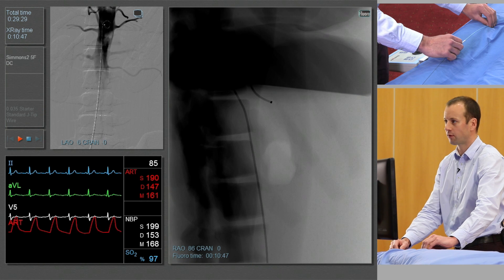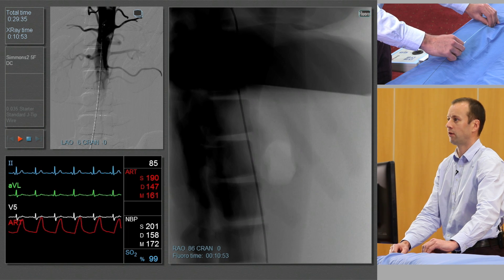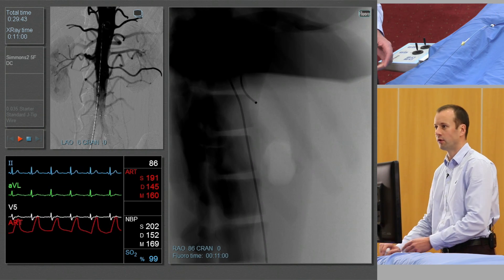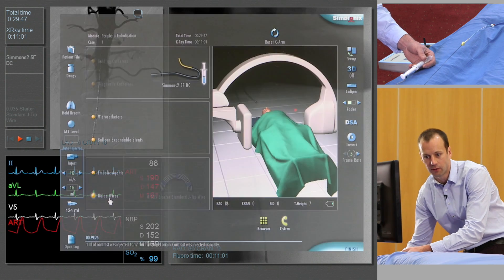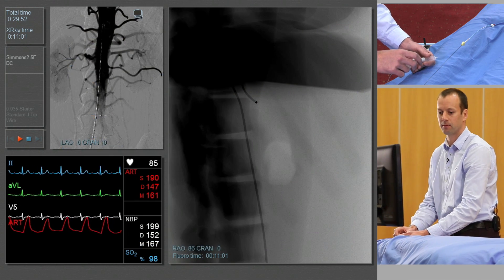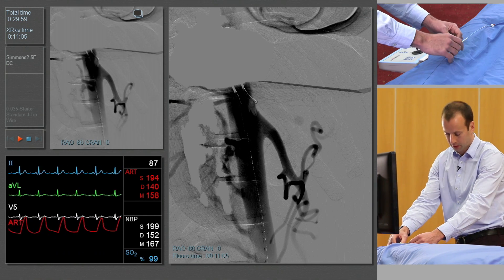To disengage from the celiac artery, we push the catheter back up into the aorta. We can see a poor view of the catheter because of the diaphragm, but we're now back into the aorta. At this point, we should do another subtracted angiogram with a hand injection to try and identify the superior mesenteric artery origin, and we'll do that with a breath hold. And there we can see a clear depiction of the superior mesenteric artery.